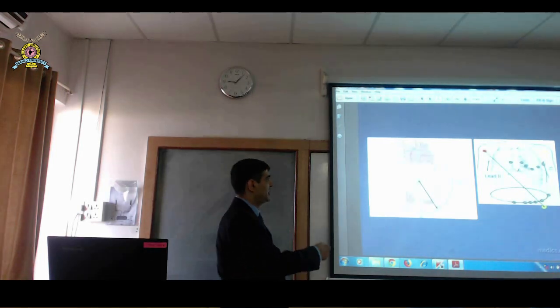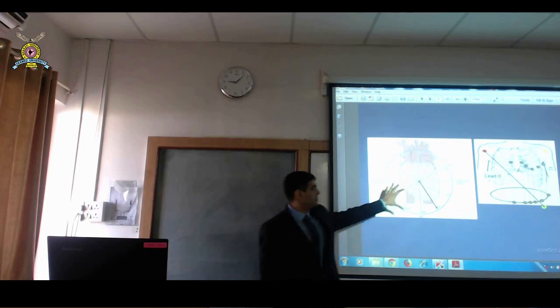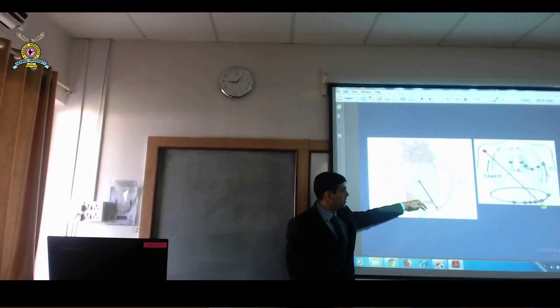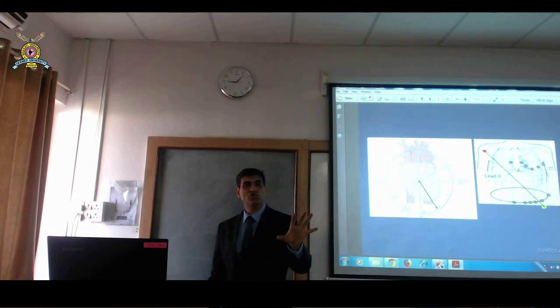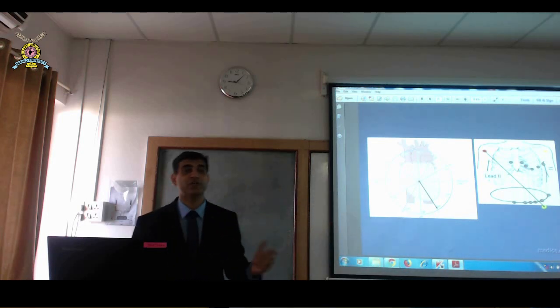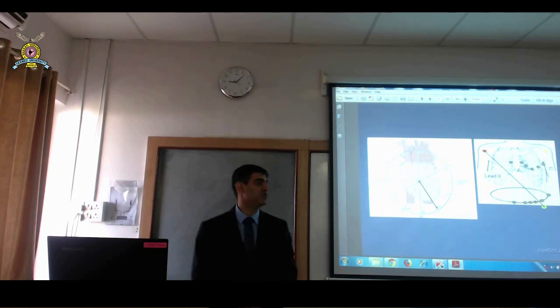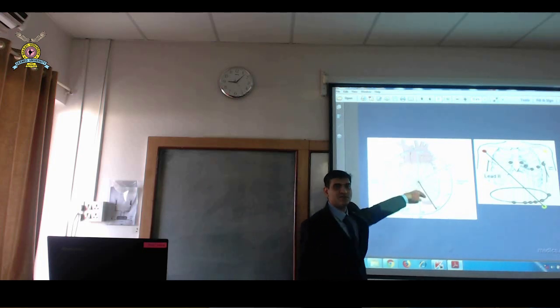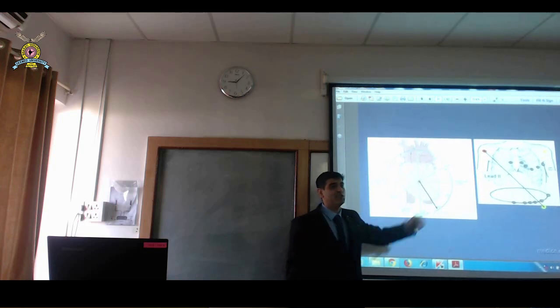That's what is represented here in that circle diagram. So the signal travels this way. This is the left ventricle here. The signal is traveling this way. It is going to see lead 2 as positive. Now see your ECG. Most of the time, is lead 2 positive or negative? Positive. Right? Why is it positive? Because the signal always travels this direction. Have you ever seen lead 2 as negative?